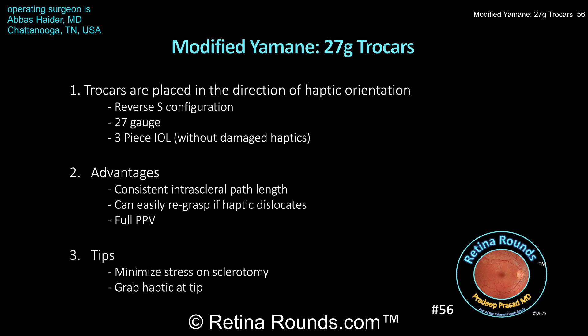This technique will be performed with a three-piece IOL, and you should make sure that the haptics are not damaged when rescuing an IOL. If the haptics are damaged, a new three-piece IOL should be used. Some advantages of the Yamani technique include easier, more consistent intrascleral path length. Since trocar placement is a routine procedure for vitreo-retinal surgeons, but you do need to enter a bit flatter — with less of an angle between the stiletto and the scleral surface — to ensure that the sclerotomy is long enough before entering the vitreous cavity. Also, if the haptic dislocates back into the eye, it's straightforward to replace the trocar and re-externalize the haptic. Using Max Grip forceps to externalize the haptic is a much simpler technique than docking the haptic in a needle prior to externalization.